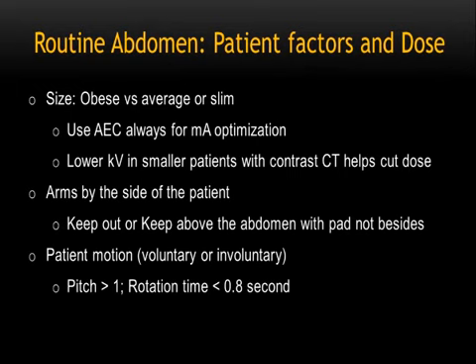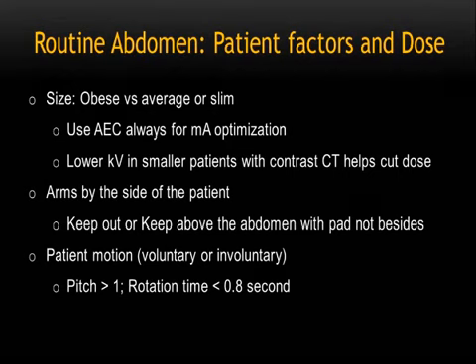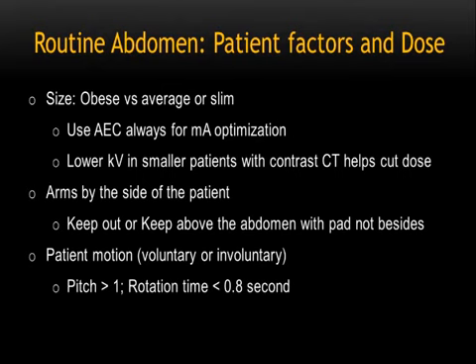Another thing is arms. Whenever possible, keep the arms out of the field of view. It especially bothers me because we do a lot of post-mortem imaging. None of the dead bodies move their arms out. Not surprising, right? So we have to tie them out to take them out. Sometimes these dead bodies have been dead for a while, and they are quite stiff, and you do require a lot of arms to move these arms, right? But it's extremely important. I cannot overemphasize this, to keep them out.